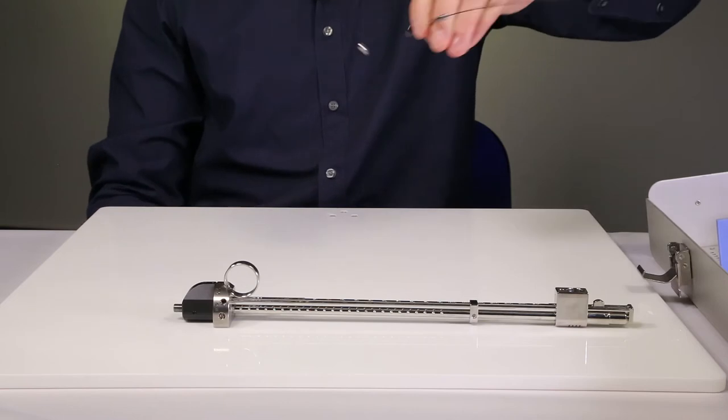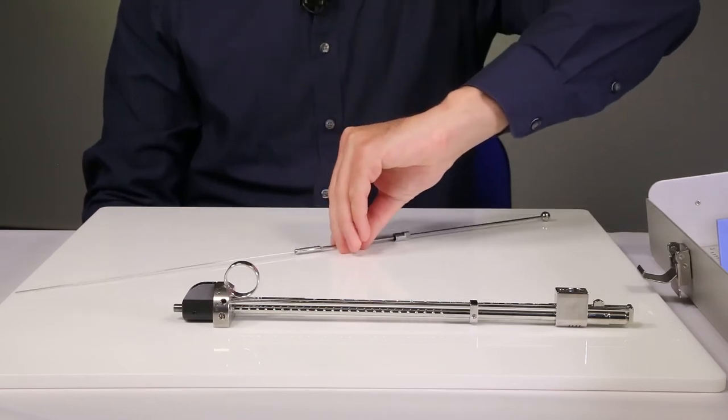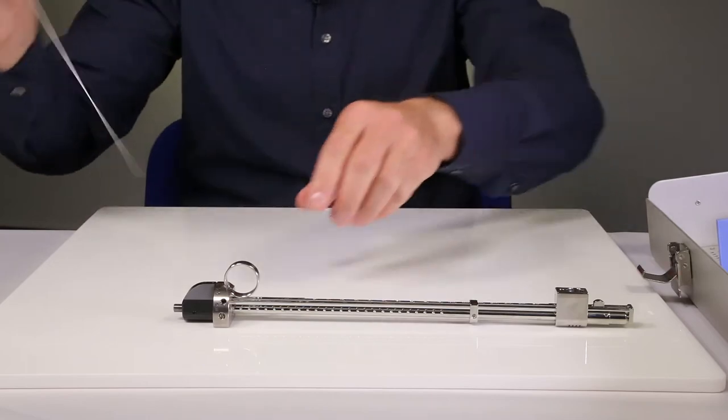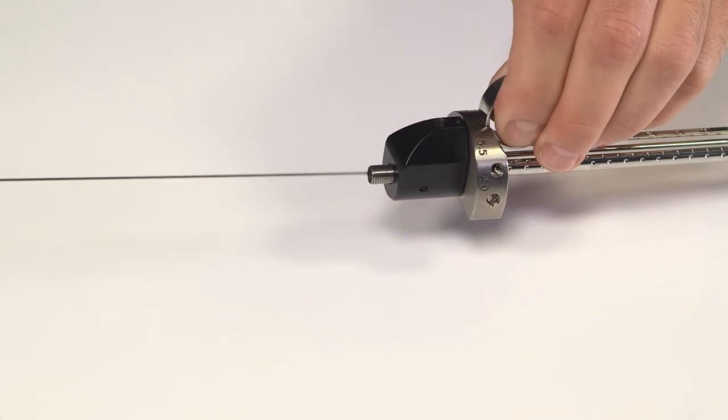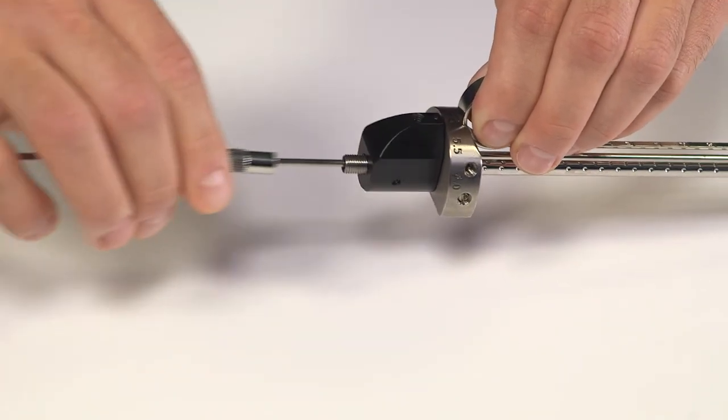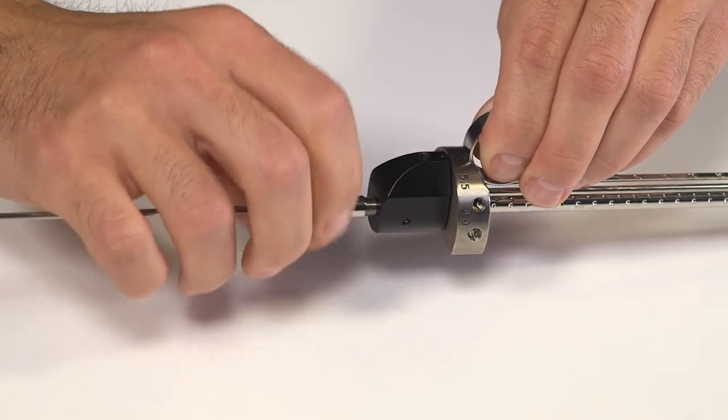In order to assemble the applicator, carefully insert the push wire rod into the main barrel and turn the cap clockwise until it's tight.